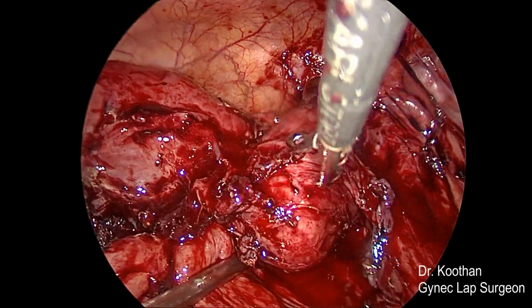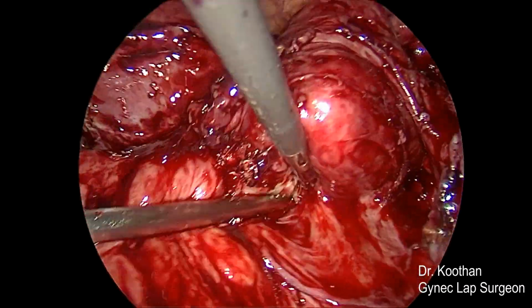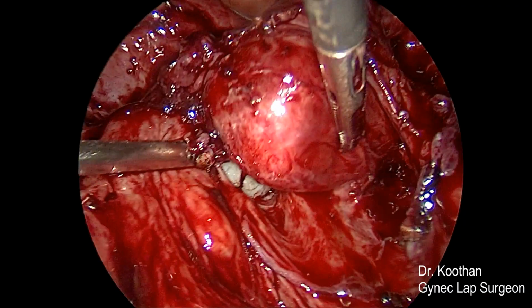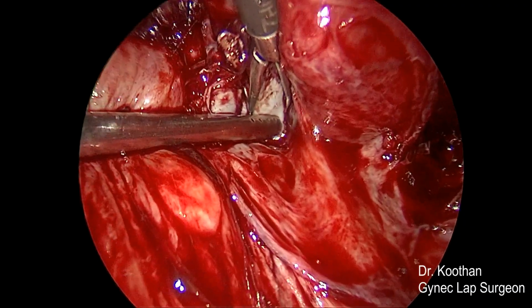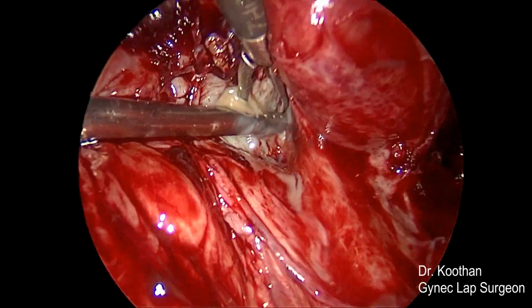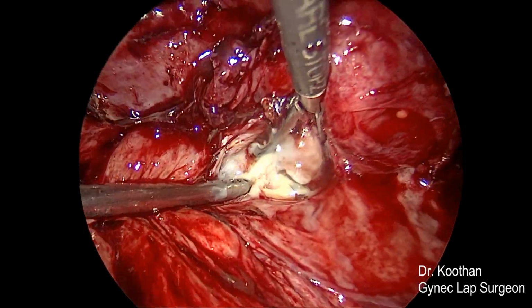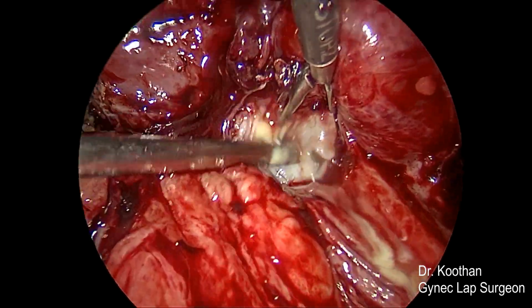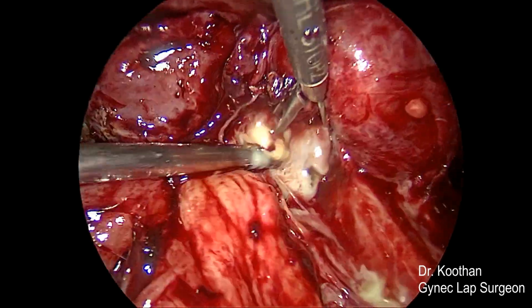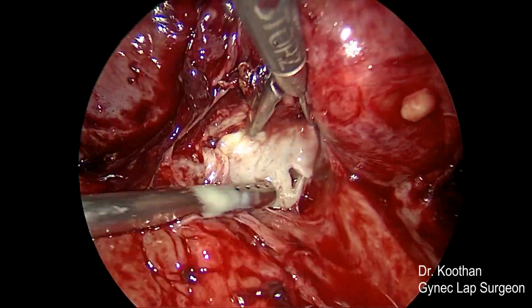It's a hard indurated mass. It's all hard. It has become fibrosed. Long-standing Pyosalpinx and endometriotic adhesions can become fibrosed. And she was on Dynogest for a long time, which can also be one of the reasons for dense pelvic adhesions and fibrosis. You can see the pus coming out.